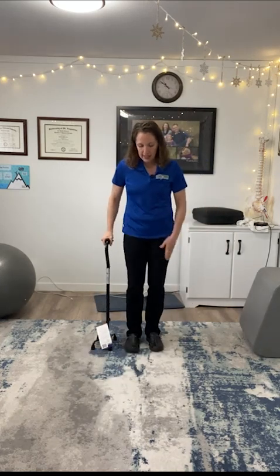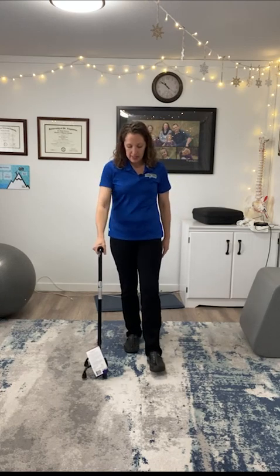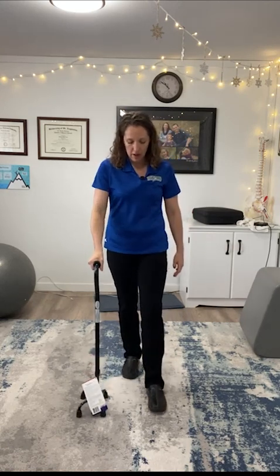So to walk with it, I'm going to have it on the opposite side of my weak leg. I'm going to take a step even with that quad cane, and the next foot can come even to it or in front of it — that part doesn't matter. And this is how I would walk with this quad cane.